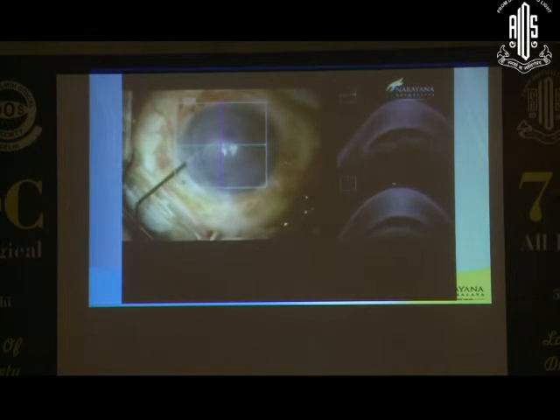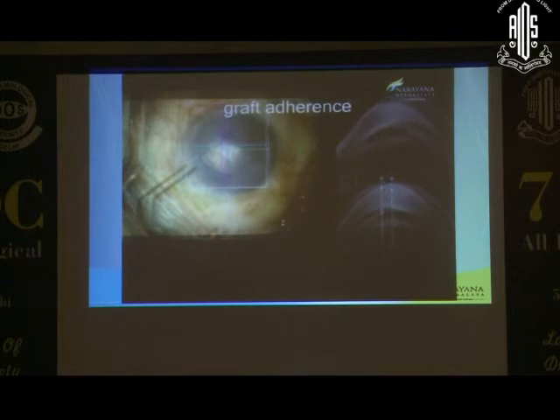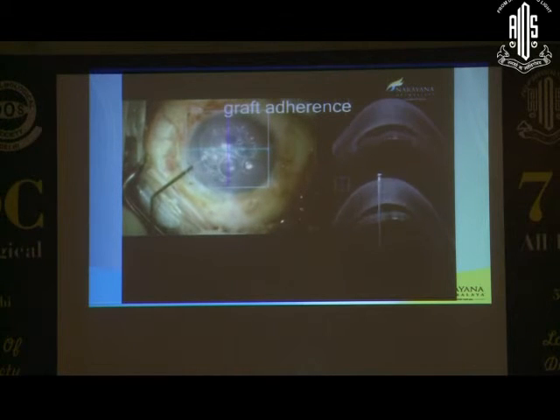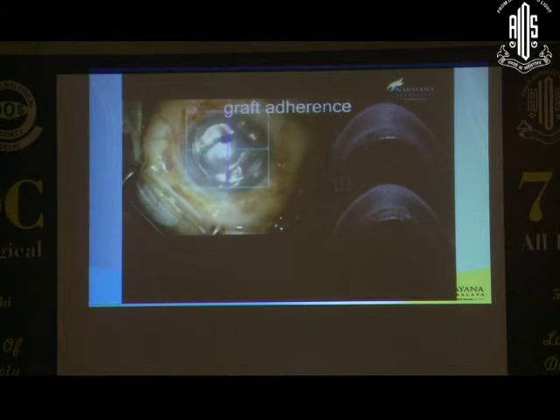Look at it, it's still not adhered. Look at the OCT picture. Despite using saline, it doesn't adhere. That's when we use the bubble, simple injection of air, which ensures adequate adherence of the graft.